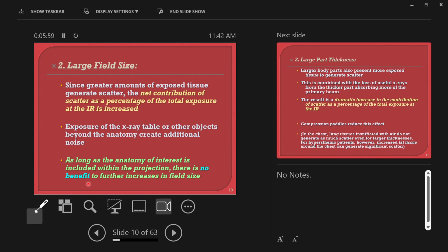The field size, right? Your radiation field. It's not exactly though. There is a misalignment between where the light lands and where the actual radiation field will be. That misalignment can be as much as 2% of the SID. So let me give you a number here. You've got your field size, and then you've got your actual radiation field that might be misaligned, and you might want to know how much that misalignment is so that you can account for it.